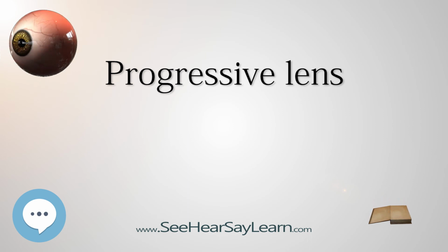It is advised that, when these symptoms set in, the progressive lenses be removed for a short period and replaced after symptoms have subsided. Returning to an older prescription or different type of lens design, bifocal, trifocal, only serves to increase the adaptation period to the progressive lenses. Depth perception and distance estimation can be influenced during the adaptation period.